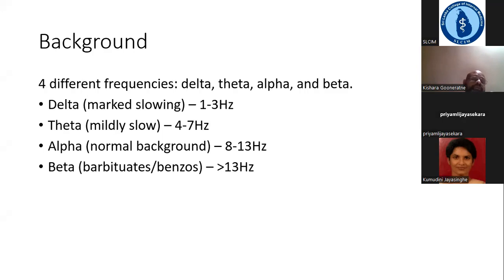It's important for us to appreciate whether this is an awake EEG or a sleep EEG, or whether it's a transition between awake and sleep, and that is generally annotated at the bottom by the EEG technologists. We need to know that to understand whether this background is normal or not, right?